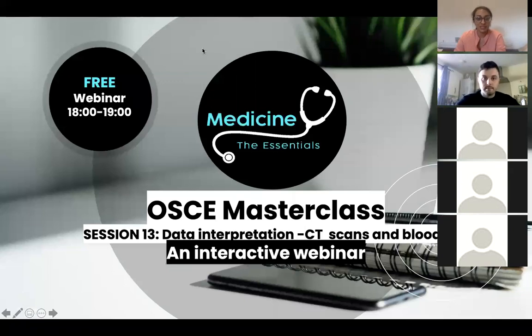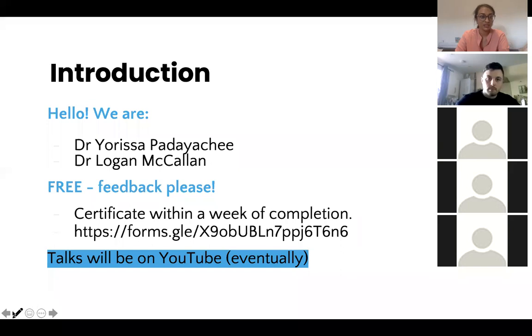Today's session is on data interpretation. We're focusing on CT scans and looking at some blood results. So just a quick introduction.